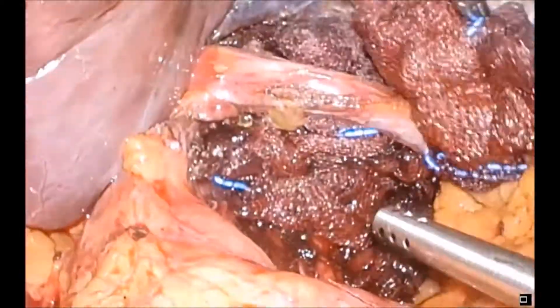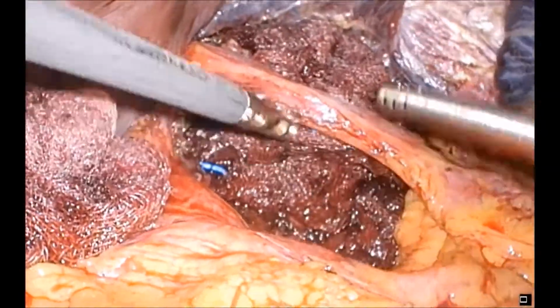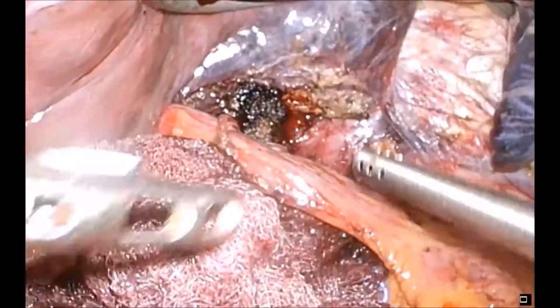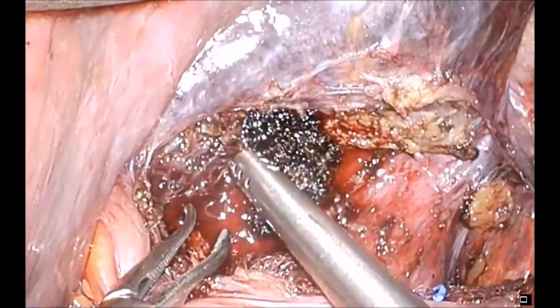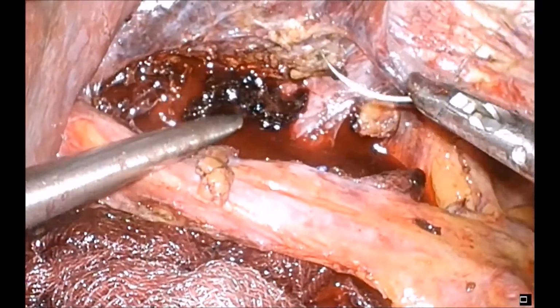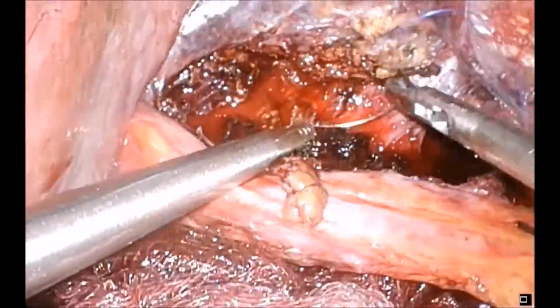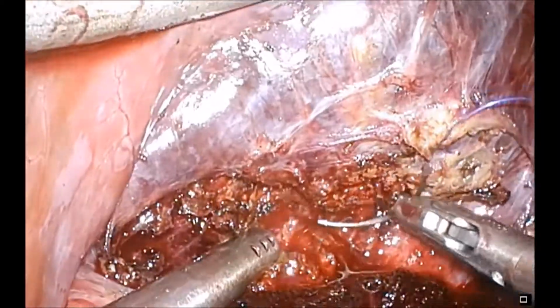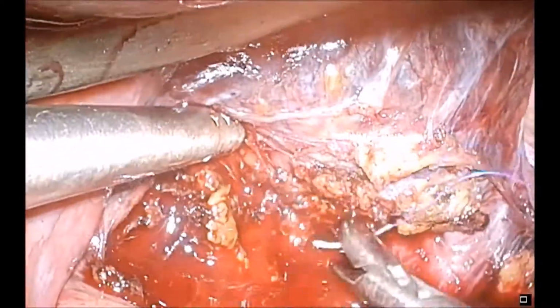Now, after that Pfannenstiel's been closed and the specimen's removed, we can come back and remove the packing around the raw surface and determine how to best control this annoying bleeding area. In the end, it was elected to suture it, as the precise bleeding point could not be picked up and clipped or controlled with bipolar diathermy.